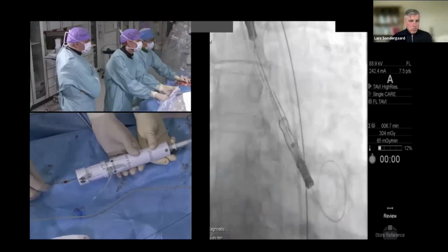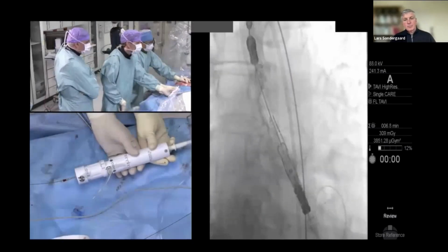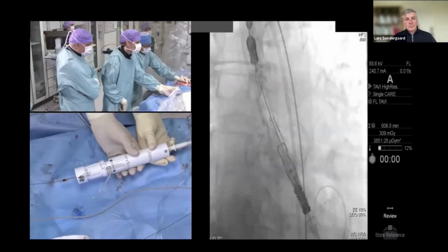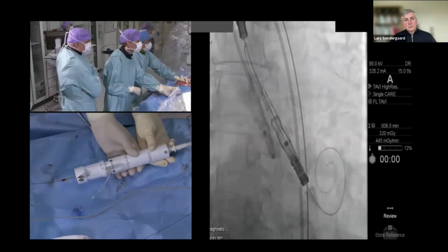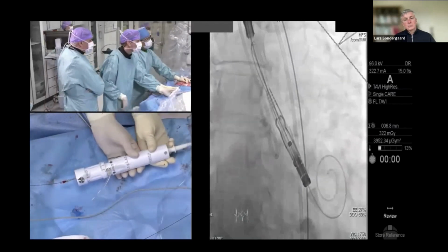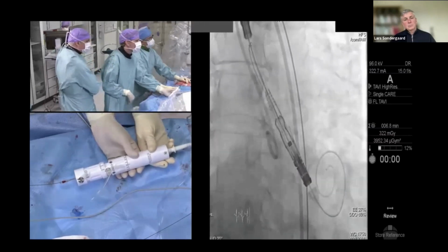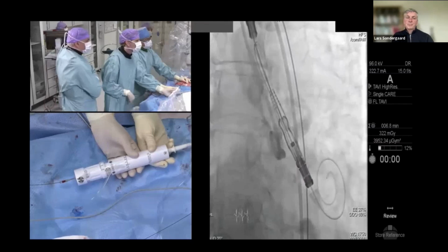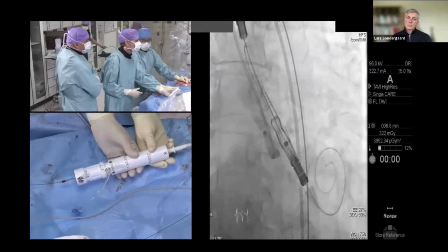We will also want to see the top of the stent above the visible calcified leaflet edges, which it appears to be. And now let me make a first injection here. Oh. So you see, we just have to notice that there may be one millimeter down to the bottom of the cusp, but we have space. We're still above the calcium, above the rims of the leaflets. Not much though. We're nearly perfect there. Yeah. What do you say? No, I think it's quite okay.